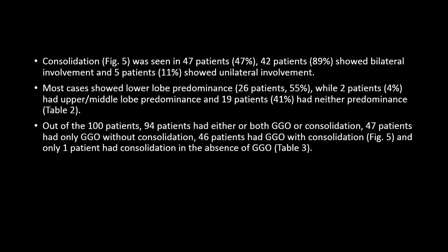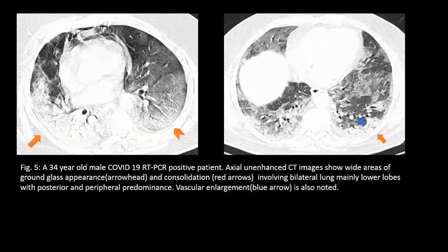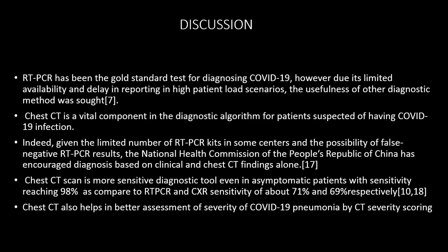Consolidation is the second most common finding, which is bilateral with predominantly lower lobe involvement. In this unenhanced CT image, a wide area of ground glass appearance is shown by the arrowhead, and consolidation shown by the red arrow involves bilateral mainly lower lobes with peripheral predominance. The blue arrow demonstrates vascular enlargement as well.